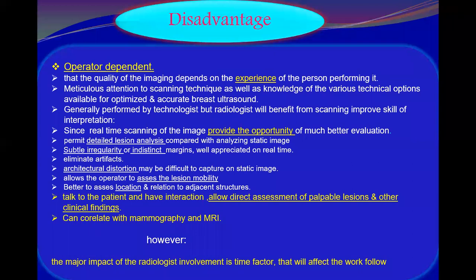It permits detailed lesion analysis compared to static images, regarding subtle irregularity, as you have seen in indistinct margins. It will definitely be better appreciated in real time than on a static one. It will eliminate the artifact, as you have seen. Subtle architectural distortion, you will see definitely in real time. You might not appreciate it on a static image.